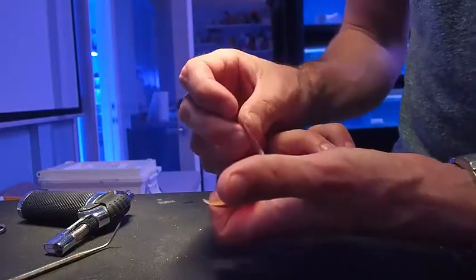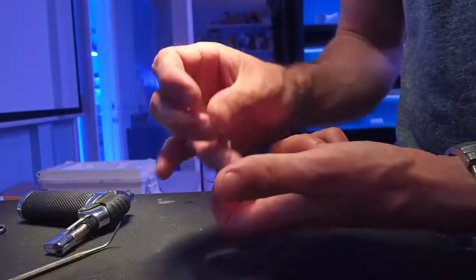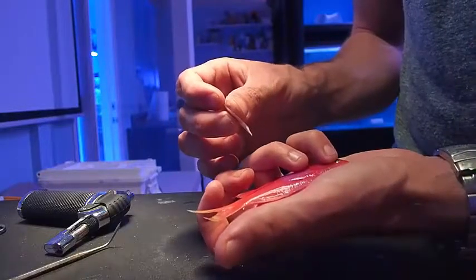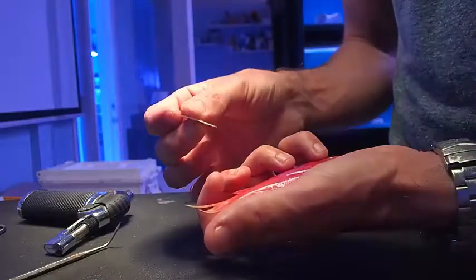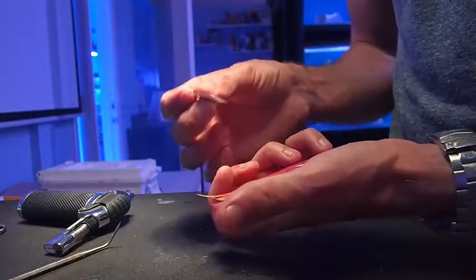This is not ideal for the fish. It's good to give them an antibiotic dip after the fact in order to compensate for the damage you did to their external surface, but at the end of the day this sample might be very valuable in identifying which parasite or disease you're up against in order to appropriately treat.